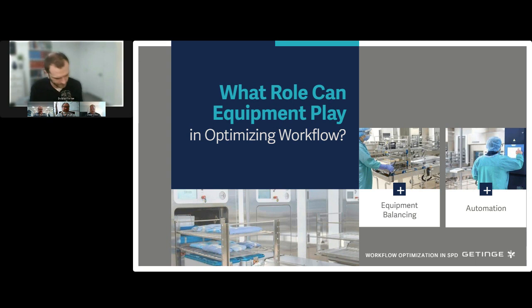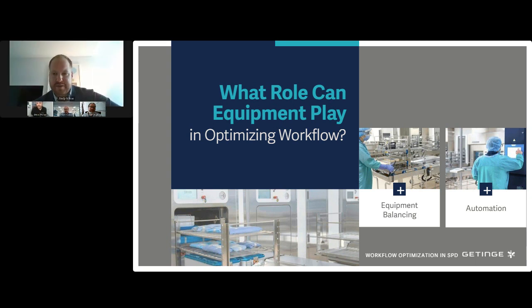Well, it plays a significant role, Bobby, and I'll give you a great example of something that I've seen out in the field. We were asked to come out to do an evaluation at a facility, and they couldn't figure out why they were bottlenecking so much in decontam. Aside from the layout where their cart washer was across the entire workflow, they had, I think it was 6 washers in place, but they only had 1 sink.